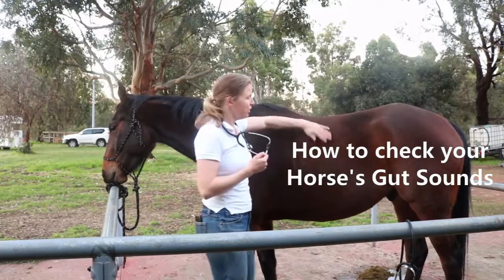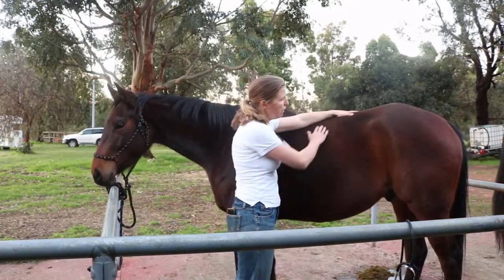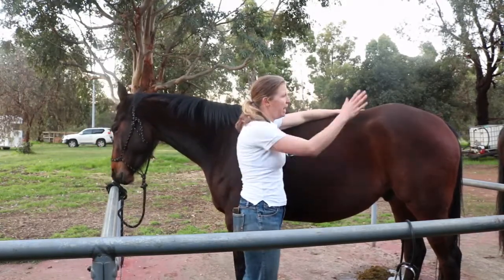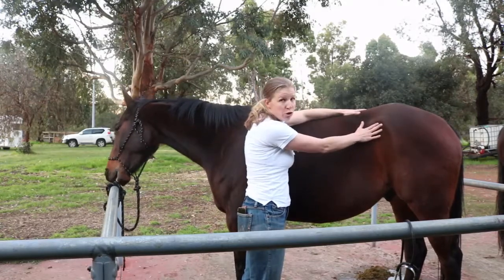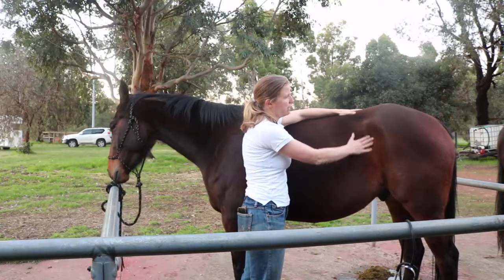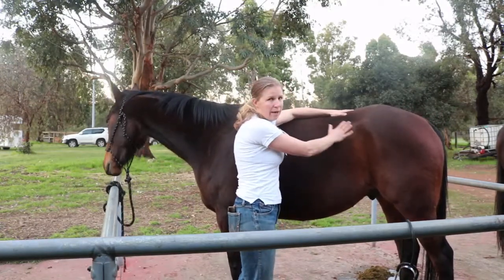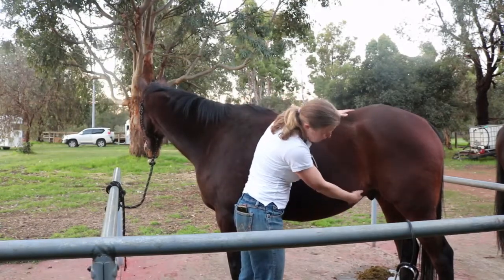I'm going to show you how to check your horse's gut sounds. We check the gut sounds with a good quality stethoscope in four quadrants. The upper left quadrant is the area right in front of the hip joint — if you feel the horse's hip and come right in front of it, you get a nice soft area behind the rib cage. That's what we call the upper quadrant of the horse's gut.